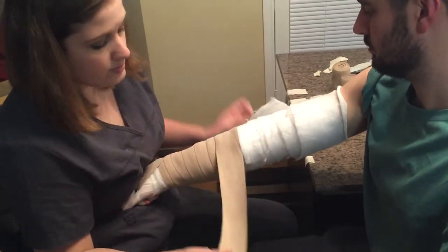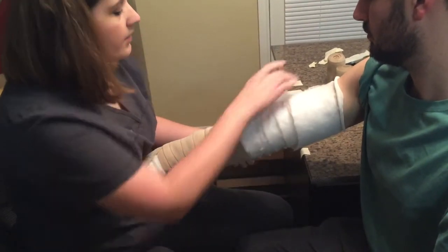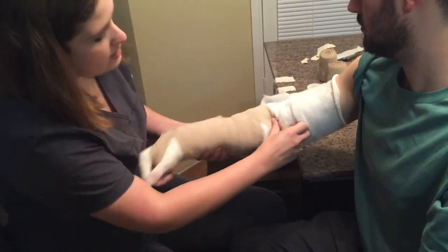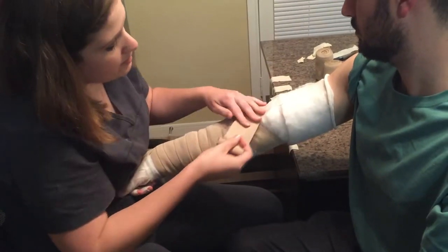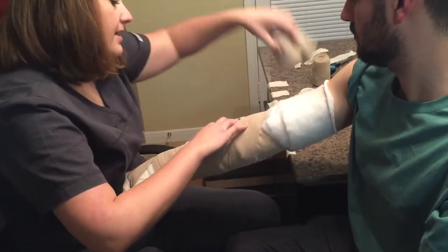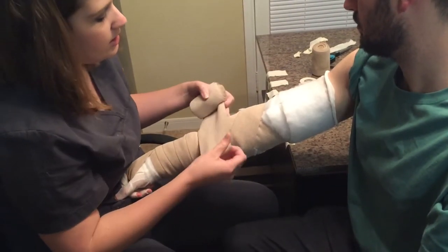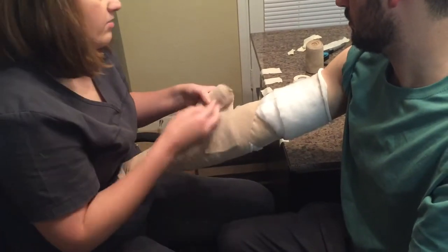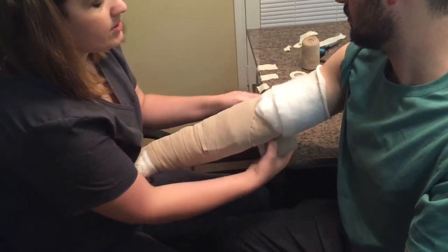Once we get to the elbow, can you bend your elbow just a little bit? When we get to the elbow, we want to do an X right here where you bend. See where that X is? We want to do that because if we don't, you're not going to be able to bend your elbow like you need to. We ran out of bandage — that's okay. I'm going to grab the next size up and start wrapping, this time in the opposite direction. See how I covered that up? At home when you're doing this, you may need to use a piece of tape. I'm just going to go over that X again so I can keep going up the rest of your arm.